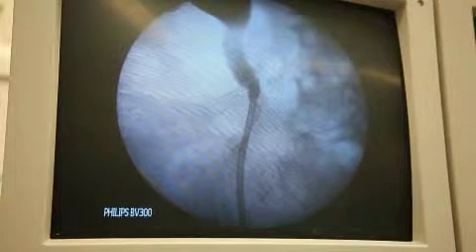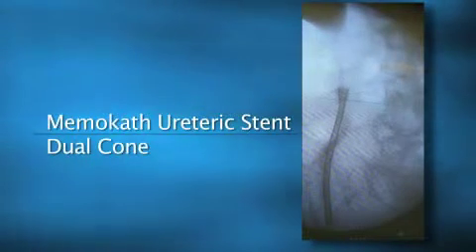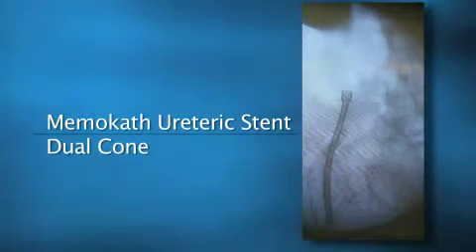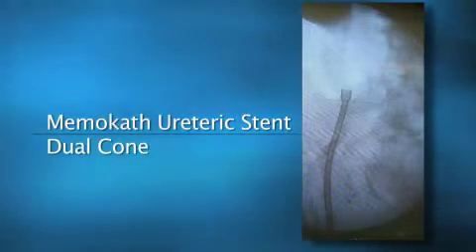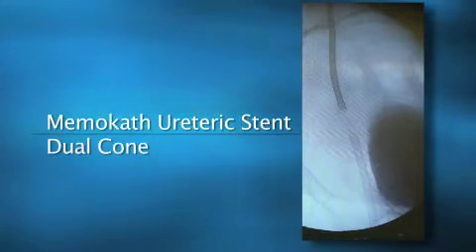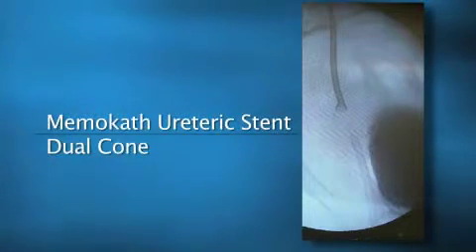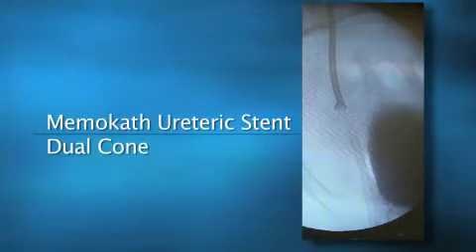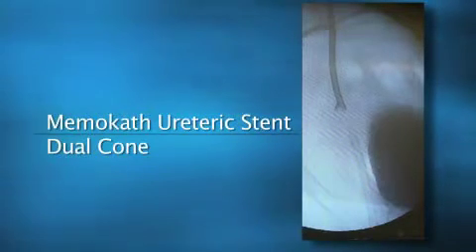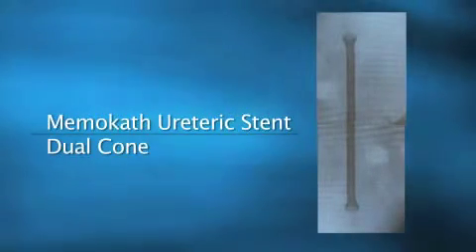Inject the hot water through the proximal end, and this will lead to the expansion of the upper part of the ureteric stent, as you can see here now on the II. Now, once we have expanded the proximal end of the cone, we then deliver hot water through the side channel again, and this will cause the expansion of the distal end of the cone. As you can see now, both ends of the stent are expanded and the stent is in good position.